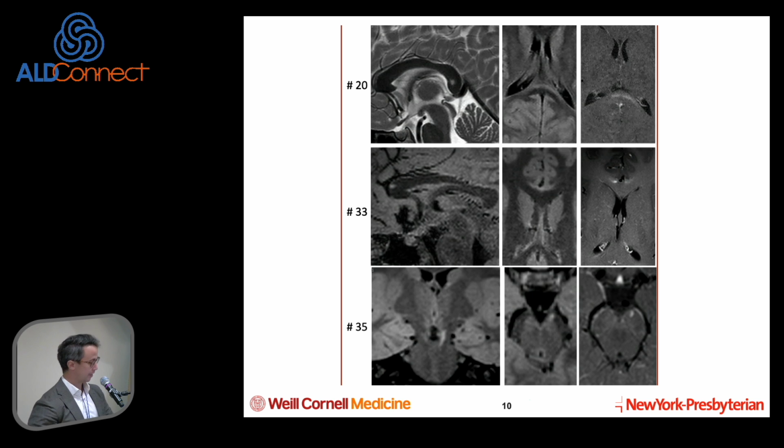So then here's another example on the sagittal view. We're looking for tiny lesions like this, which have some evidence of lesional enhancement. And this would be the stage at which we'd want to intervene, treat a patient with a stem cell transplant or gene therapy or whatever therapy may be coming down the line.